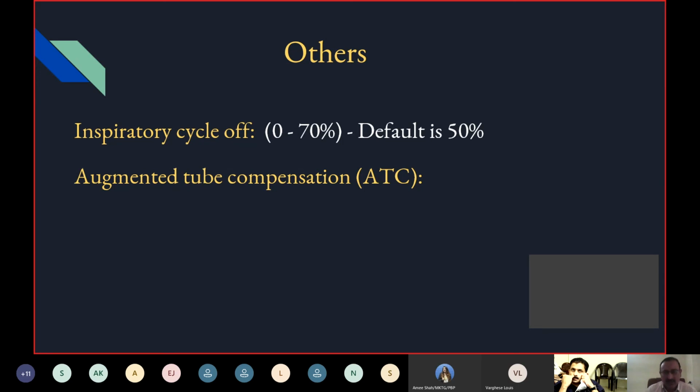So if you prolong somebody on a T-piece, then slowly there will be basal atelectasis, because he keeps on breathing and the distal alveoli will start closing, and that can lead on to basal atelectasis. It can also impede carbon dioxide going out, because oxygenation doesn't need that much air to come in, but carbon dioxide definitely needs a little bit of air to go out. So these things might get affected.